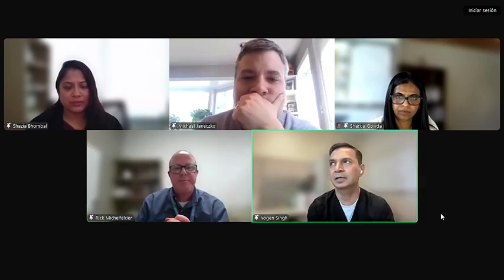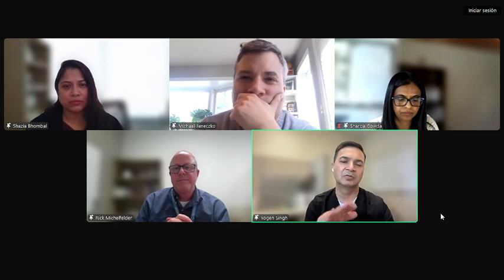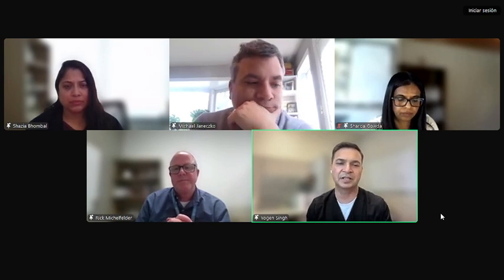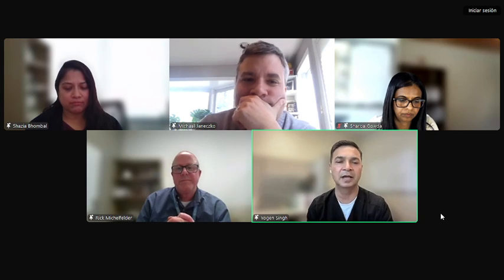I completely agree, Rick. Typically when you're doing the training and the patient is stable, not in an emergency, we definitely go with the parasternal long axis view, short axis view, apical, subcostal. That becomes their second nature, really. So when they're doing it, we are looking at those images systematically, like pattern recognition. And also they do not miss things, especially when they're not doing it very often. So I completely agree. Protocol is really helpful that way.